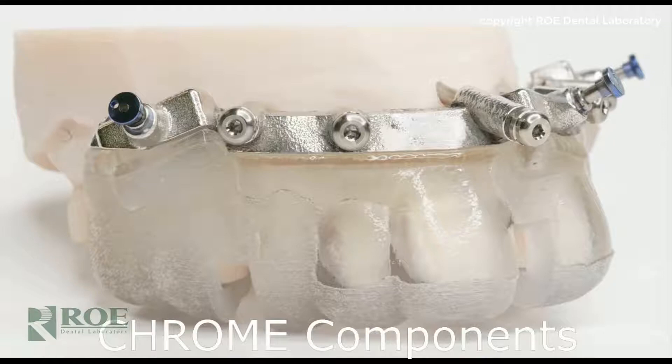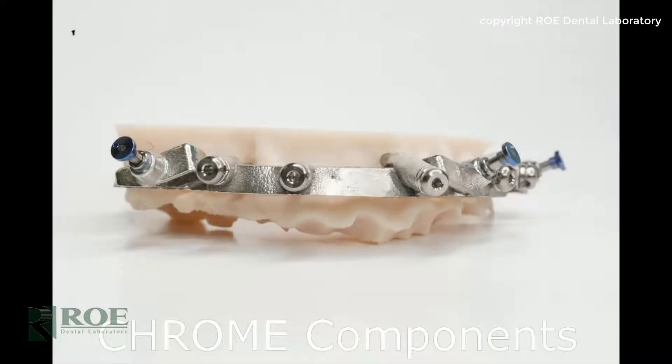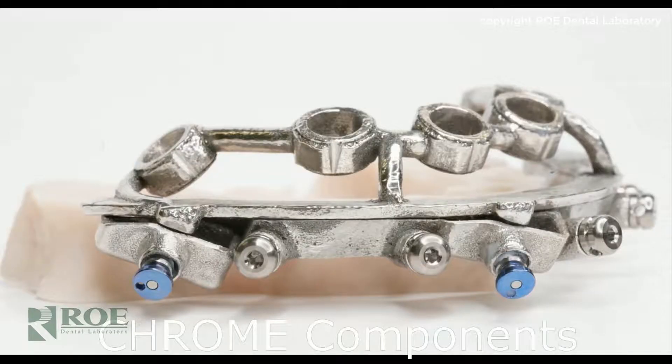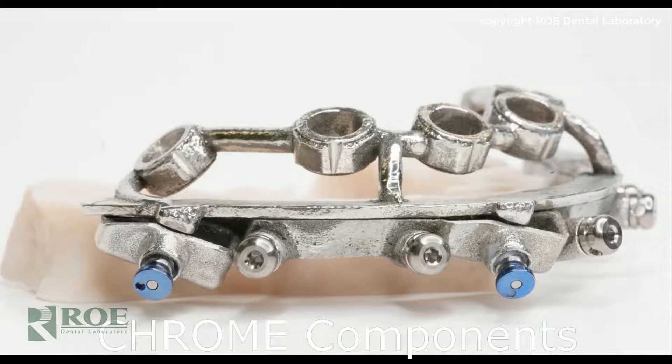This is the pin guide. The pin guide is used to deliver the fixation base. The fixation base holds and supports all the subsequent guides — it also serves as a bone reduction leveling tool. It supports the osteotomy guide, which is all made of chrome cobalt, precision-made for guided systems. The little blue plungers are what hold all the components on.